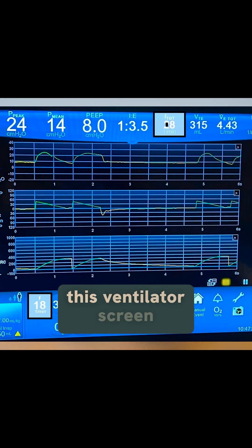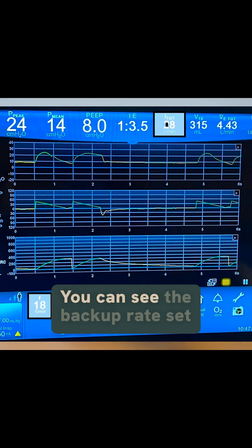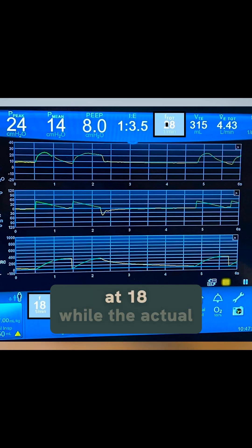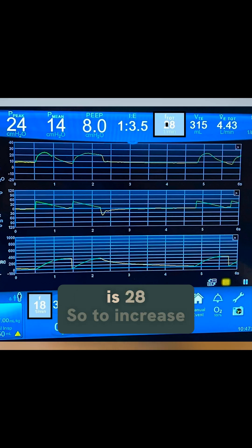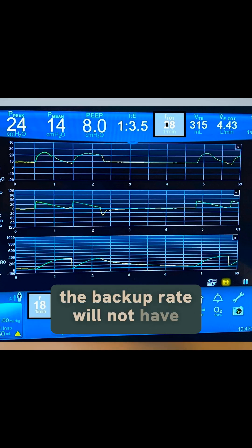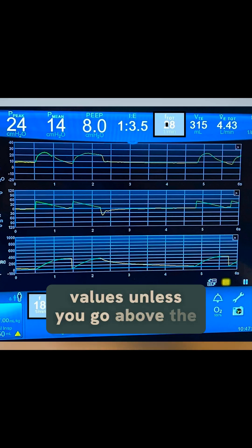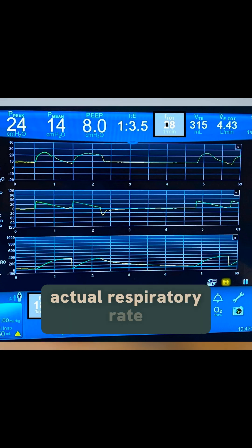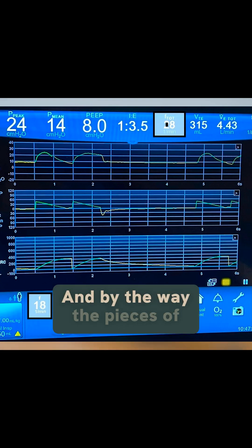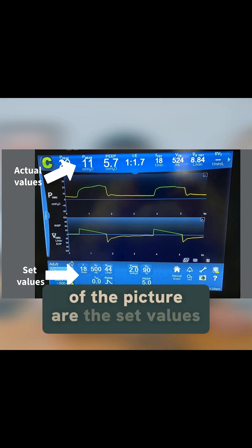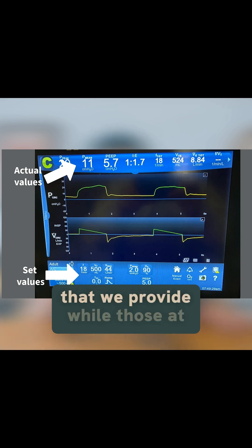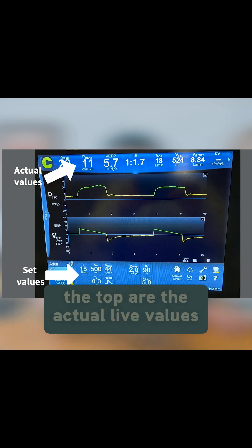Take a look at this ventilator screen. You can see the backup rate set at 18 while the actual respiratory rate on the ventilator is 28. So increasing the backup rate will have no effect unless you go above the actual respiratory rate. By the way, the values at the bottom of the picture are the set values we provide, while those at the top are the actual live values.